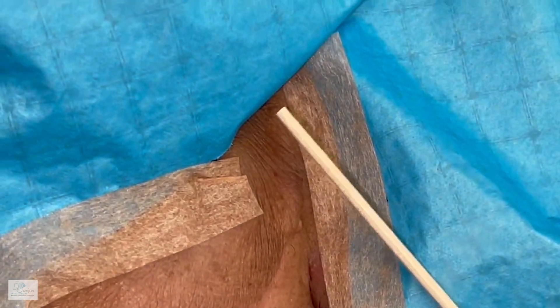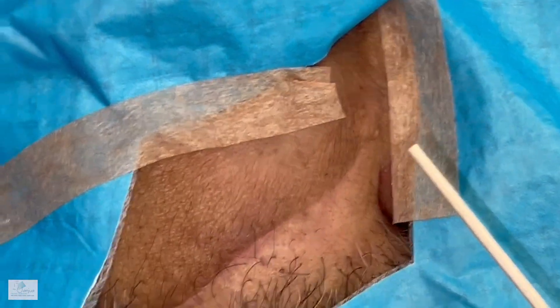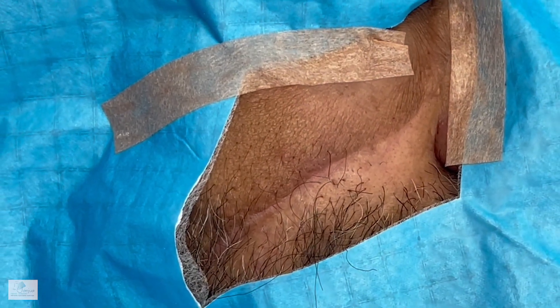As you can see, the superior portion of the scar is completely healed right there — you can't even tell, and it looks like a nice curve as well. But as we come to the cheek area, starting from here going downwards, we have some depression and some widening. We want to hide it because it's a linear scar and very obvious, so if we make it a geometric broken line closure, I think it's going to hide really well — and that's the goal today.